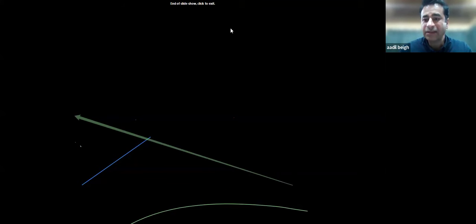So the stiffness of the guide wire depends on the balloon. If you are taking a compliant, soft balloon like Mustang, you don't need a stiff wire. If you are taking an ultra-high-pressure balloon, yes, you may need the stiff guide wire, and not always a stent.